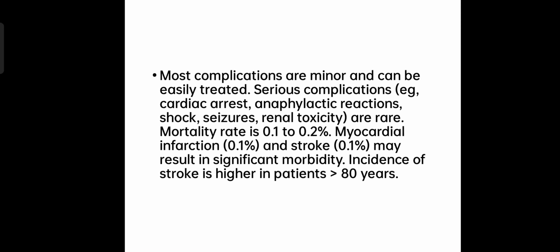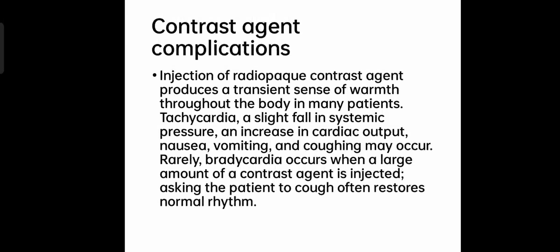Most complications are minor and can be easily treated. Serious complications are rare. Mortality rate is 0.1 to 0.2%. Myocardial infarction and stroke may result in significant morbidity. Incidence of stroke is higher in patients greater than 80 years. In general, complications involve the contrast agent, the effect of the catheter, and the access site.